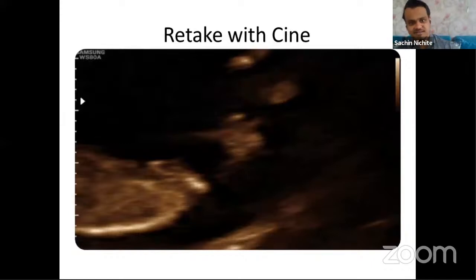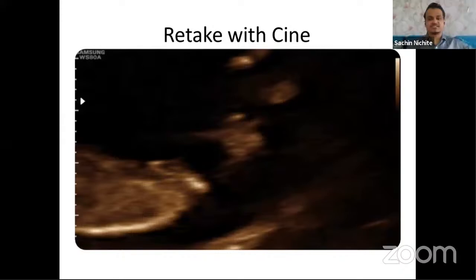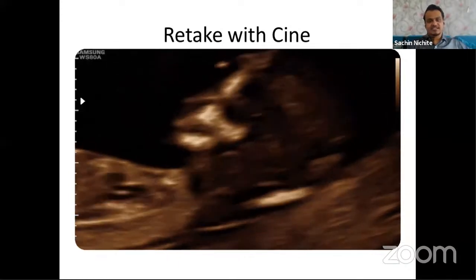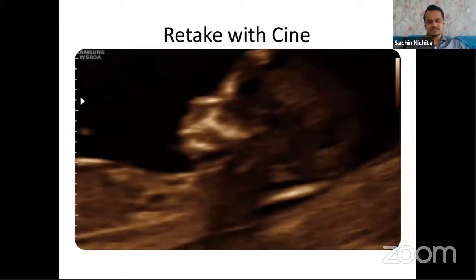Very important concept. Retake with cine. Yes, for the persons who are learning the NT scan initially, a very good thing. The habit we learn initially is we go to the NT image and press the stop or pause button, then only we get the image. We try again, we pause, and the image goes off. So it's a simple way. We take a cine loop. Our eyes, our brain know that the image has gone behind. We pause, we scroll the cine loop slowly behind and take an image.